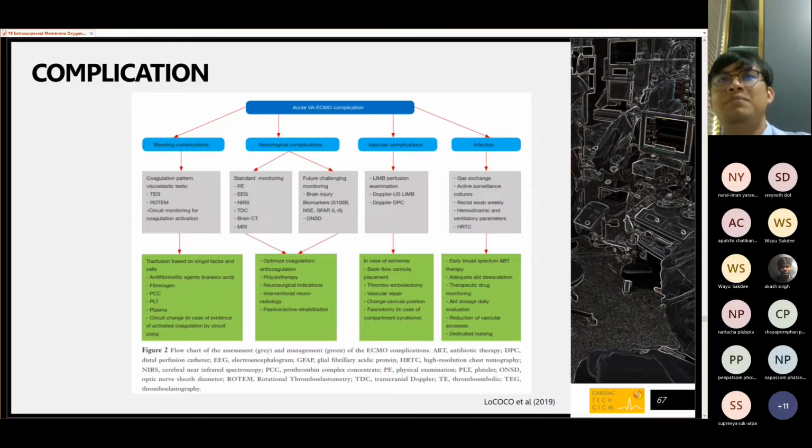And the patient is put on another extra device, another extra condition. So it's like trauma to the patient. Blood is exposed to the artificial organ, so infection is quite easy to go up.